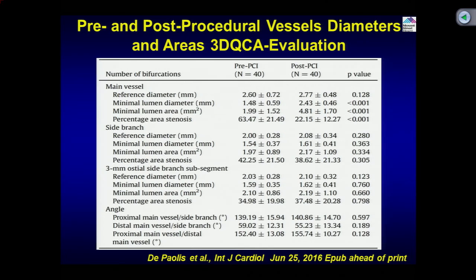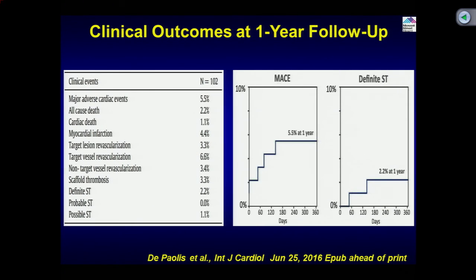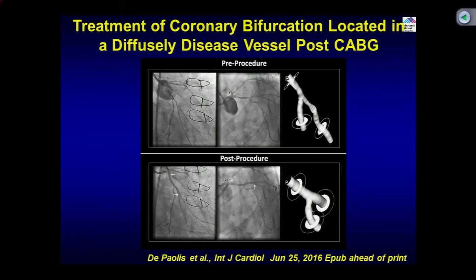Usually, if you see the ABSORB II study, they found slightly lower side branch compromise in the Absorb compared to Xience, which is a little unusual, although in ABSORB III we found a little more side branch compromise clearly with the large strut. So, that concern is always there, but overall studies have shown okay results, with slightly higher, as I mentioned, scaffold or stent thrombosis of 2.5 or 3%, which usually we know is about 1 to 1.5, and of course overall reasonable MACE and mortality in this large series of patients.